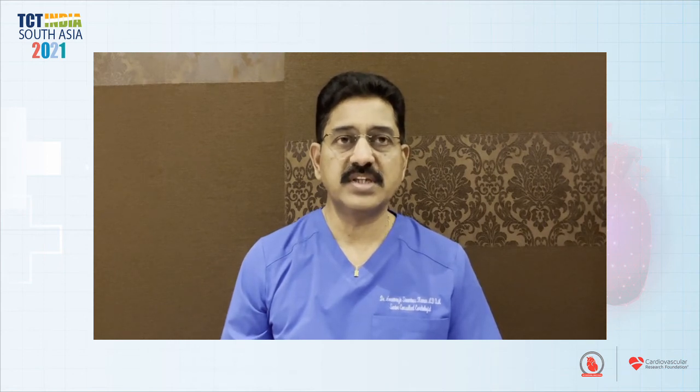These aspects of coronary AV fistula closure, and the use of the guide catheter along with the coronary wire, give impetus to adult interventional cardiologists and coronary intervention specialists to network well with pediatric colleagues. That is how we could do good together for these children, and bring out other interesting procedures like ductal stenting, again an extension of coronary stent usage in the ductus. The same device is also used for VSD retrograde closure, where all the looping and other mechanisms were removed and the procedure was simplified.